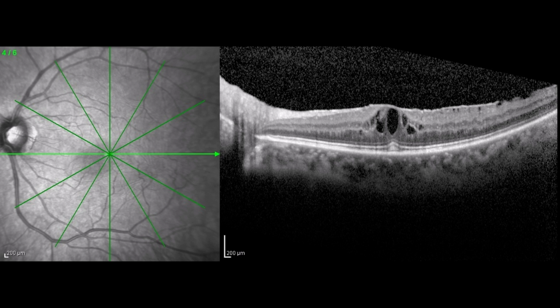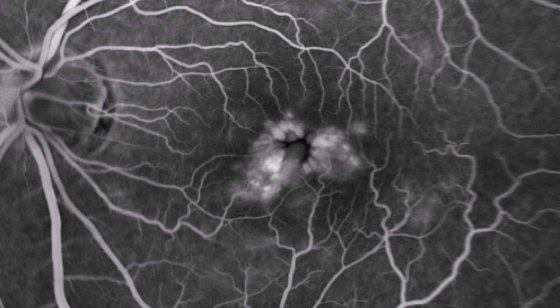It's a little bit convex. Probably if this were purely an epiretinal membrane, it wouldn't have caused this kind of configuration. And in fact, this patient was post-phaco, and this is CME related to that, which resolved with just topical therapy. So I probably operate a lot less than I would have had I not had spectral domain OCT. It's a love-hate relationship. So this is intraretinal fluid accumulation due to a drug. The patient's actually on systemic Avastin for her metastatic breast cancer, but she's also on Abraxane.